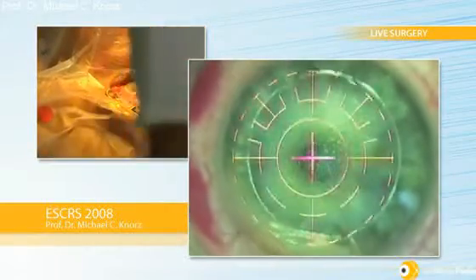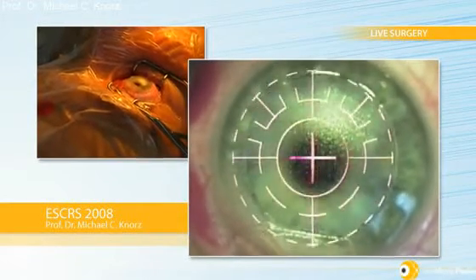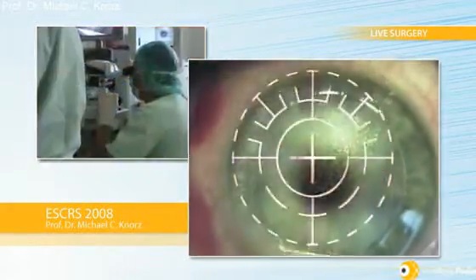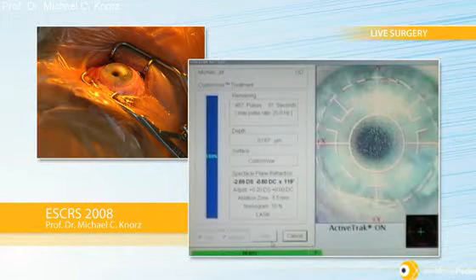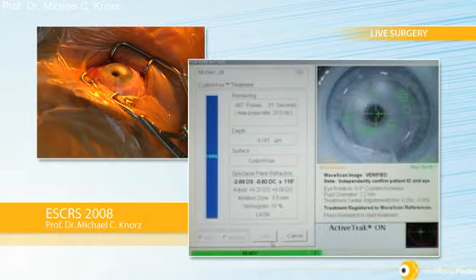I tell the patient to look at the blinking light and dim the lights. Now I will engage iris registration. We've got very nice iris registration — the rotation is just 0.4 degrees and the off-center is 0.29 mm.